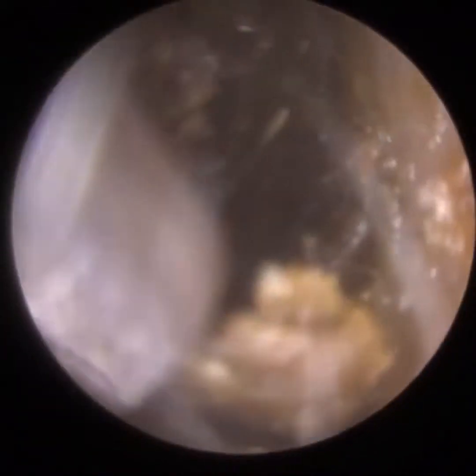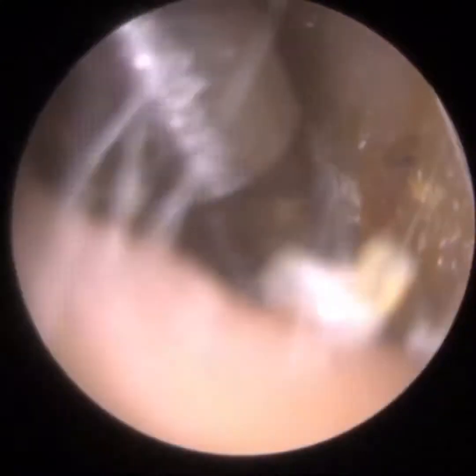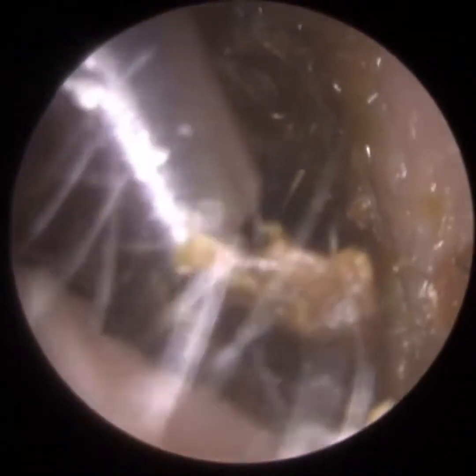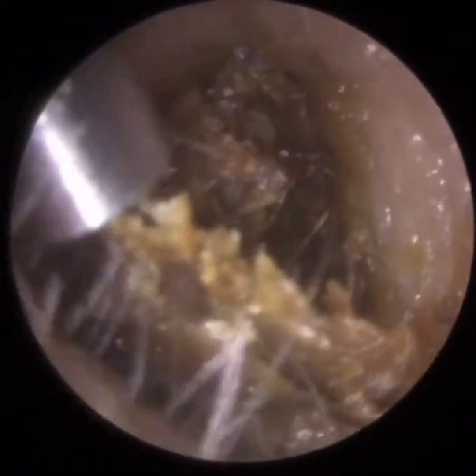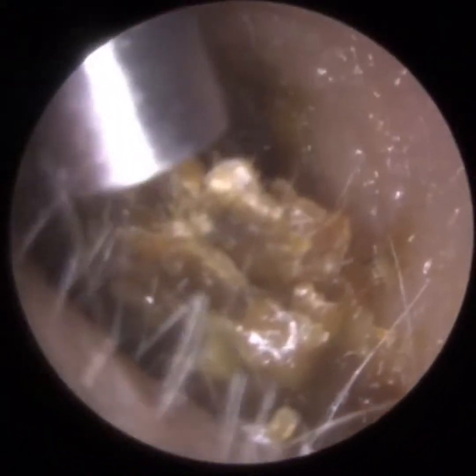So for those people who perform earwax removal, there's a bit of a weak spot. If you've got a big plug of earwax, like in this case, when you enter the ear, in the case of the right ear, which is the ear we're working in at the moment, there's a bit of a blind spot to the left, so to the posterior canal wall, which is the back part of the ear canal, near the entrance laterally. If you can loosen that, like I am here, it can then facilitate easier extraction of the rest of the plug. And you'll see the same technique in the patient's left ear.